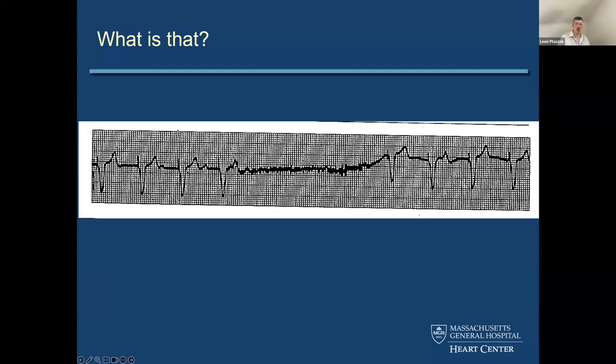But again, like that tracing we showed at the very beginning, you see what appears to be isorhythmic dissociation between the P wave and the QRS, suggesting that this is somebody with sinus rhythm in whom it's a single chamber system, right? Because you're pacing the ventricle, and it's not pacing throughout, so it's clearly not asynchronous, right? So you're pacing and sensing in the ventricle, but it's not clearly asynchronous, and there's no evidence of synchronization of A and V here.